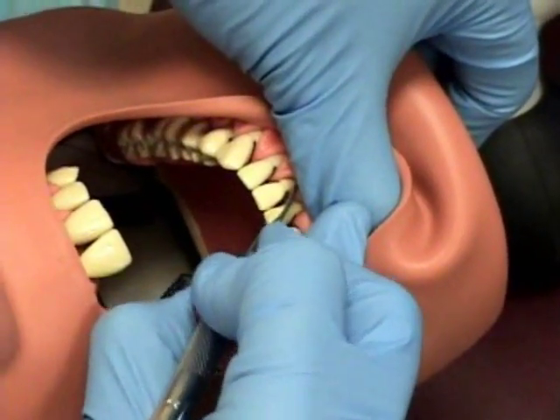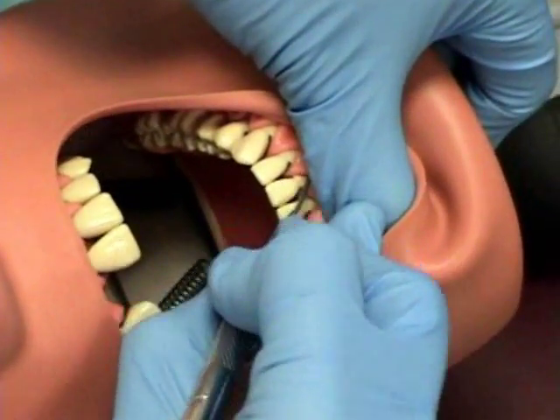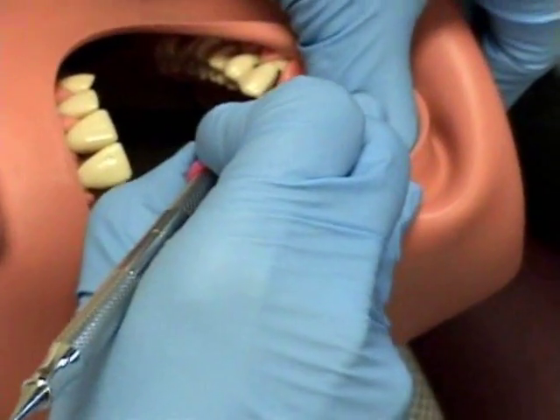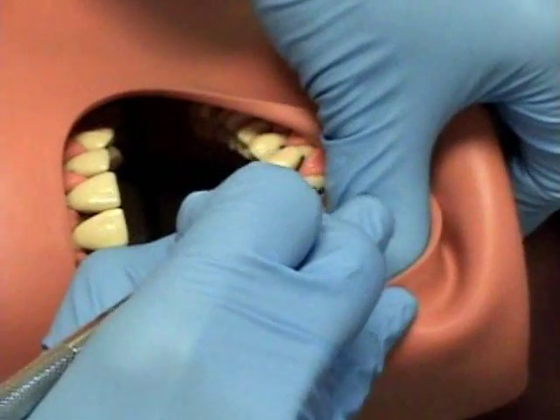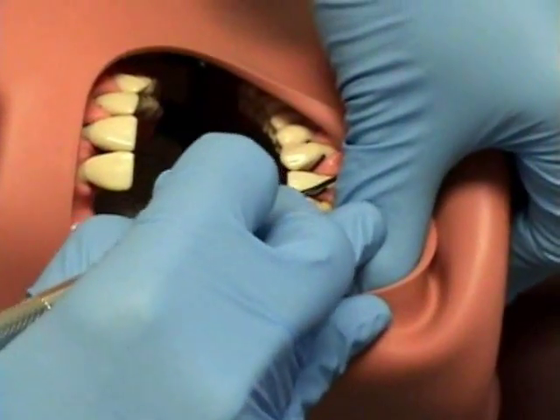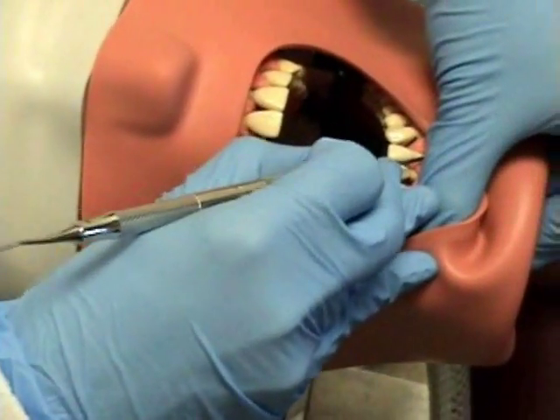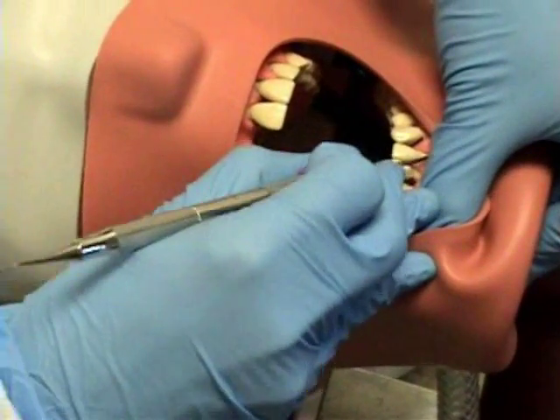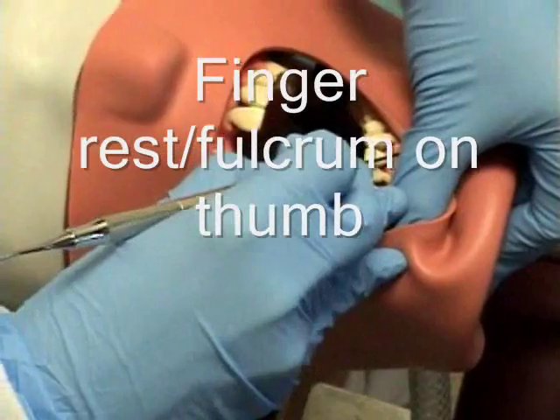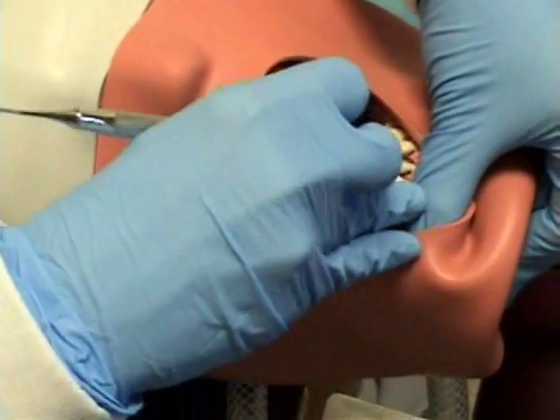Oftentimes you have difficulty finding a stable fulcrum in some patients' mouths. One technique is to use the finger or thumb of your non-dominant hand to fulcrum. Ms. Johnson is using her thumb to both retract the lower lip and to fulcrum. Ms. Johnson is using the Sub-Zero curette and fulcruming on her thumb. Now she has a very stable fulcrum.